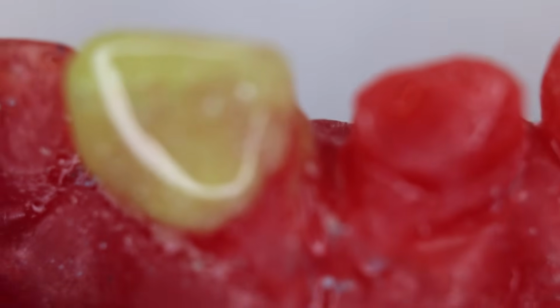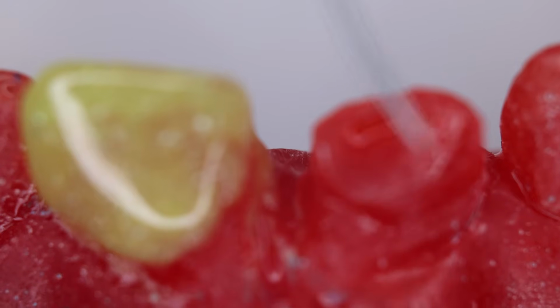In the previous session we restored it step by step. We learned how to restore the strip crown on the tooth number 6-1. Today we are going to restore on the tooth number 5-1. So again, repeating the same steps.